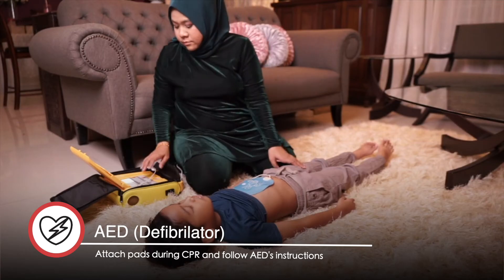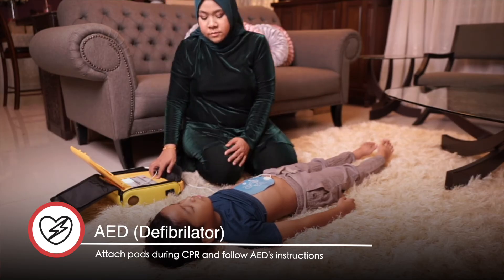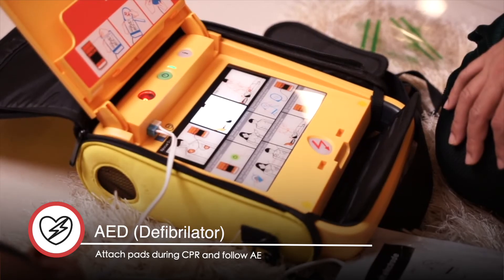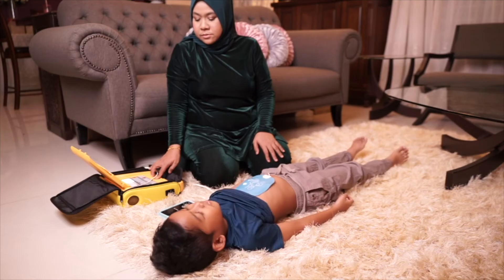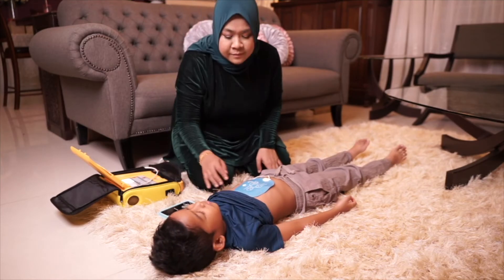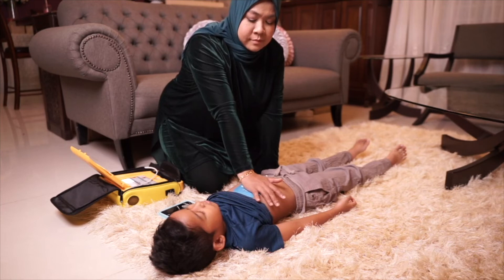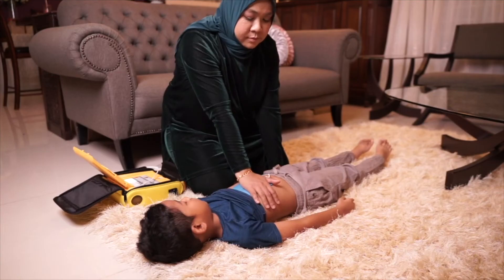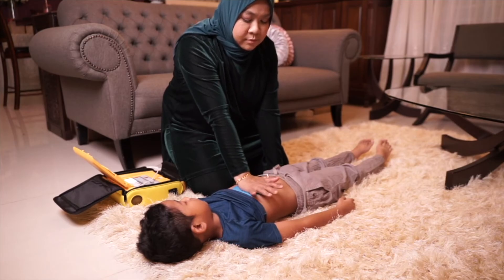Make sure that nobody is in contact with the casualty while the AED is analyzing the casualty's heart rhythm. Follow the instructions of the device, which will indicate whether you should administer a shock or continue with chest compressions. Continue in this way until the emergency services can take over, or until the casualty begins breathing normally again.